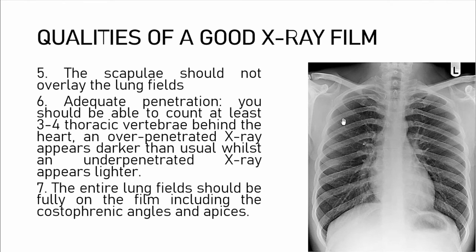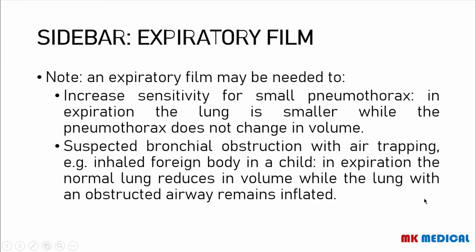And of course, the entire X-ray should be on the film. So you should be able to visualize the lung apices. You should be able to visualize the diaphragm. You should be able to visualize the costophrenic angles. Once you do this, you have ticked the technicalities of the X-ray and you're ready to read the X-ray systematically.